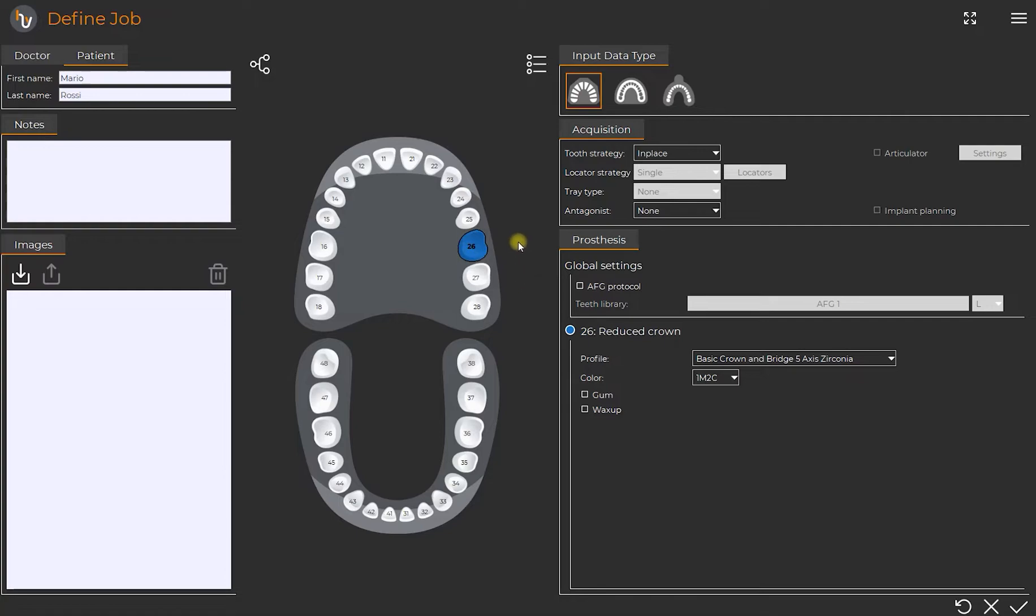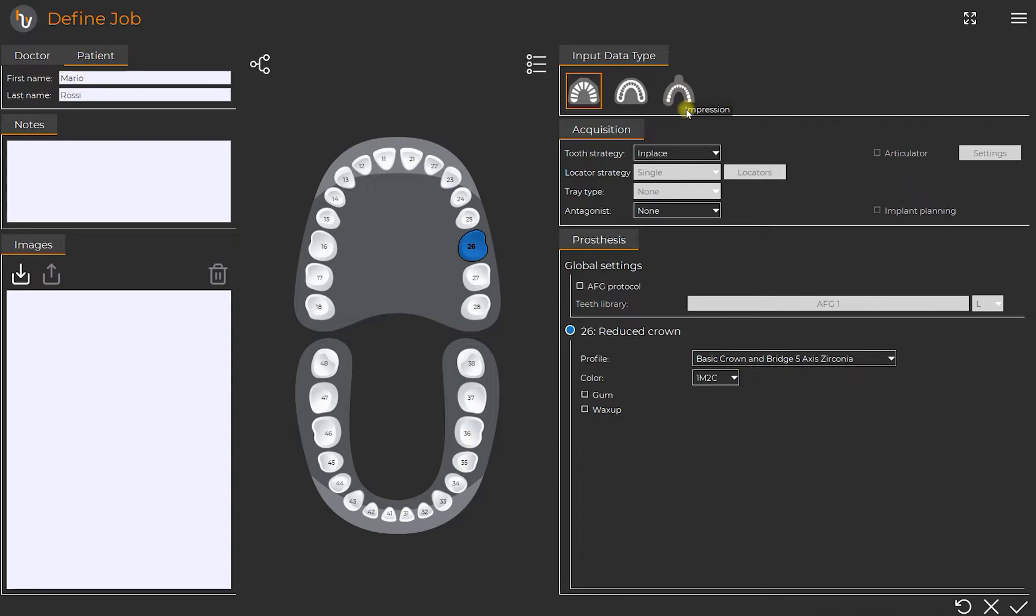On the top right we provide the kind of data used for this case: prepared model, raw model and impression. In this case we will start from a prepared model.